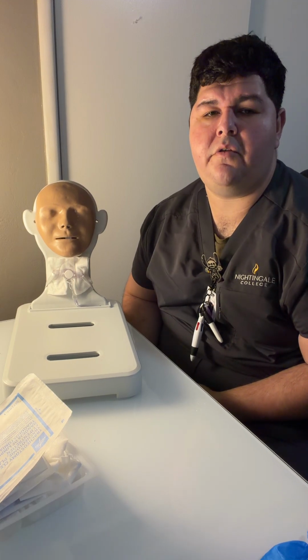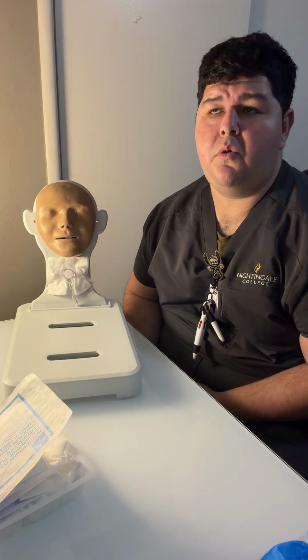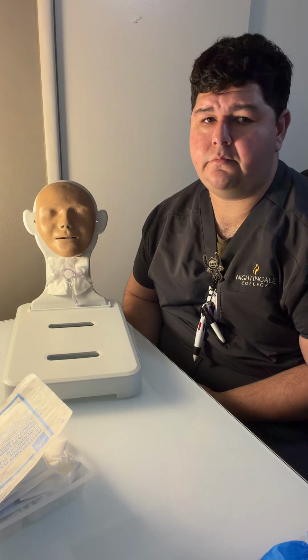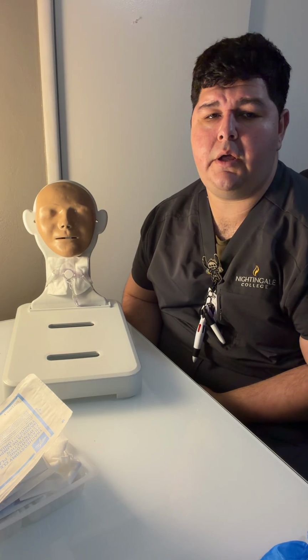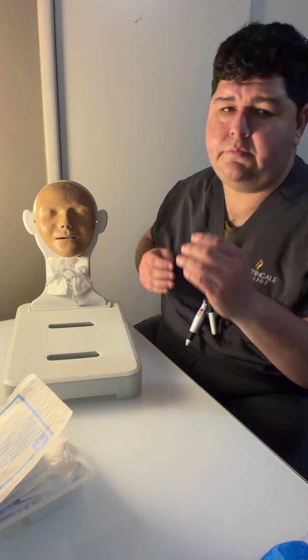Hello, my name is Jose Miranda Velasquez, and I'm going to demonstrate the tracheostomy care for BSN 266. We want to ensure that we have the provider's orders for this patient and the trach care. Once done, we're going to start by entering the patient's room. We close the door behind us to ensure patient privacy, and then we perform hand hygiene.